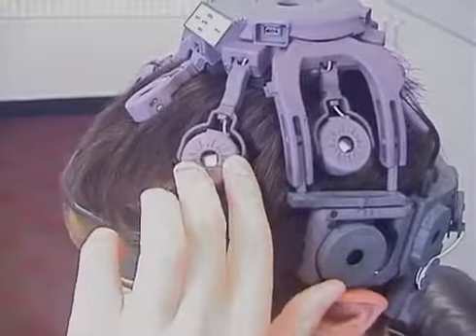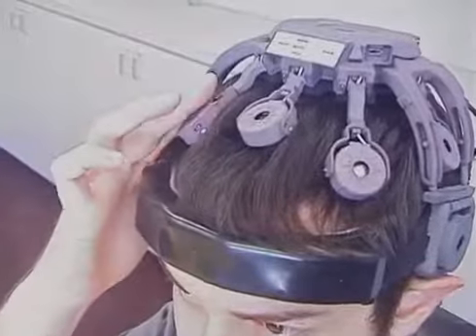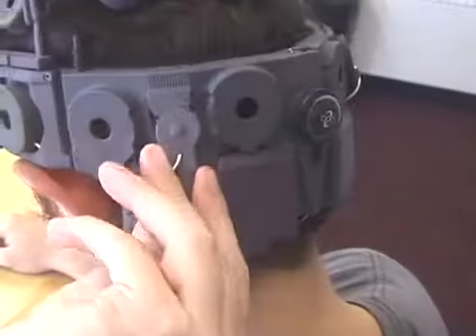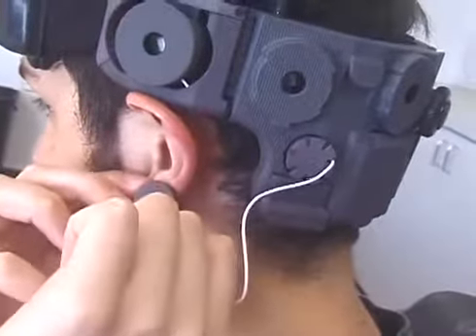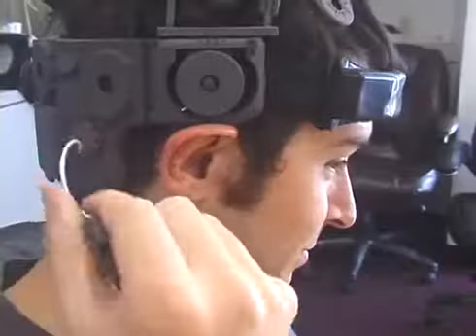Rotate those sensors — only making contact on their edge — so that they make full contact with the scalp. The ear clip electrodes are at the back of the headset. Unspool the lead and clip the electrode to the ear lobe. Do this for both sides.